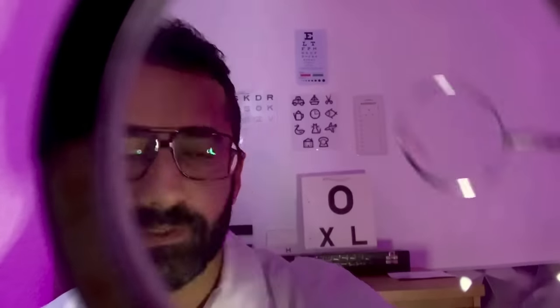Just need to do a little bit more lens three or four. As you're looking at the round object again, is it clear with lens three or four? Three — three or four — good. And for the next set, that is lens three or four? Three or four — so we have no apparent cylindrical element to the prescription.